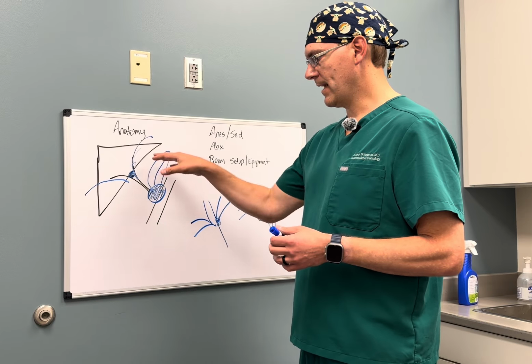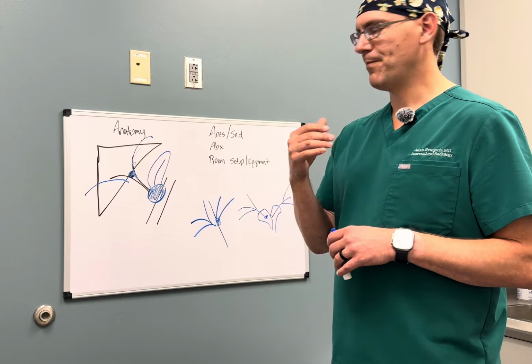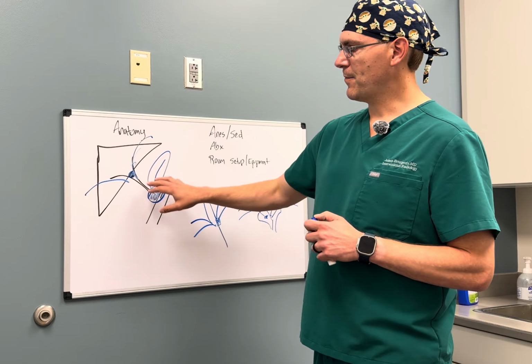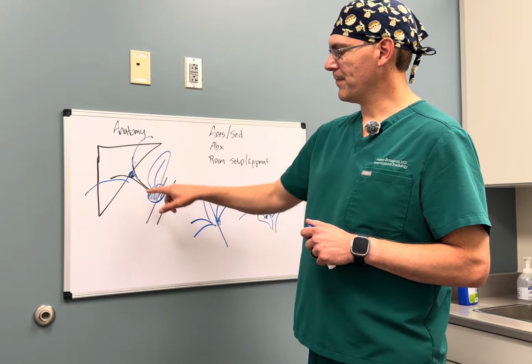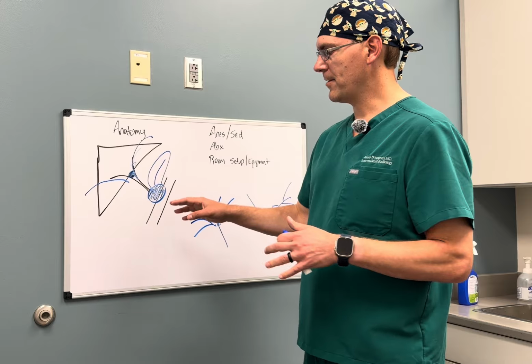And so that would be a situation, again, for us, where we would be thinking about a single drain and using sedation. So we've got two major obstructive patterns. We've got hilar and we've got distal common duct. We've got what we've tried to accomplish.